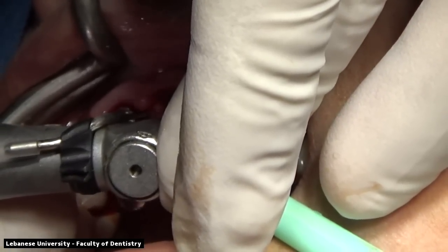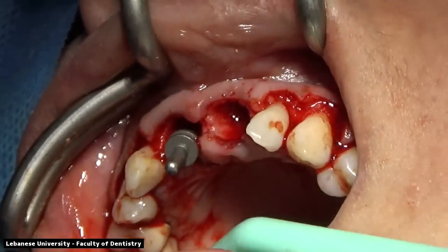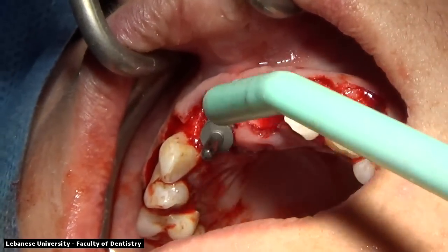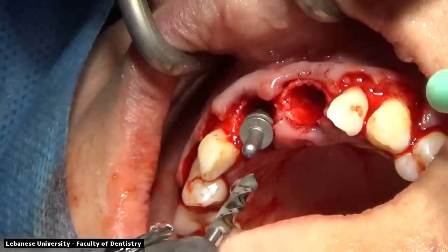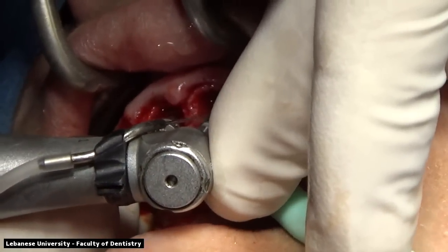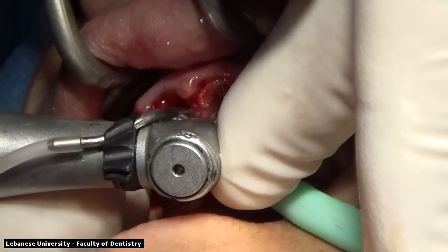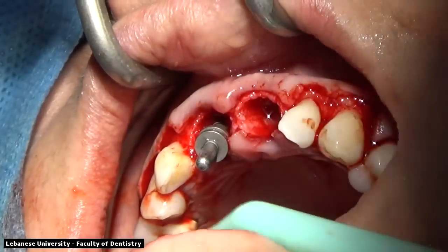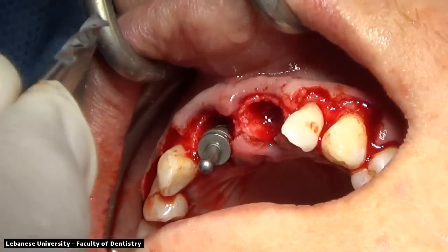On the left central incisor, we're using our 2 millimeter twist drill. We're using the buccal plate of bone also as a guidance, and we're going to the 13 millimeter marking on our 2 millimeter twist drill. Once we're done with our 2 millimeter twist drill, we're going to move to the next burr size, which is the 2.8 millimeters. And the 2.8 millimeters will also go all the way to the 13 millimeter mark on both sides. Once we have our direction and our guide placed, we can use the guide on the right side to help us on the left side, so that we can always be parallel. Both implants will be placed parallel to each other, and the emergence profile will be parallel, making it easier for the restorative dentist.